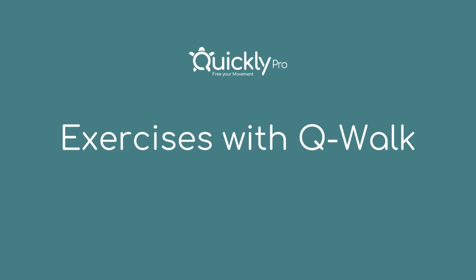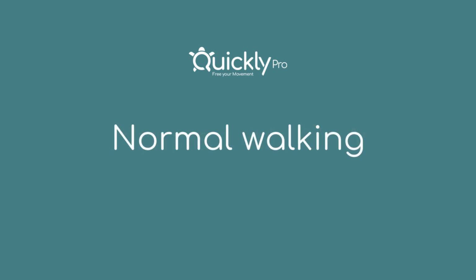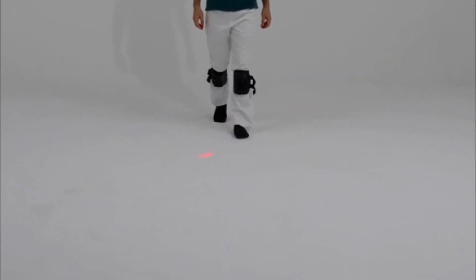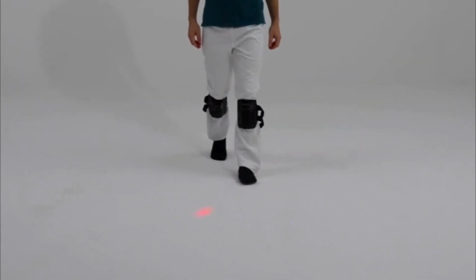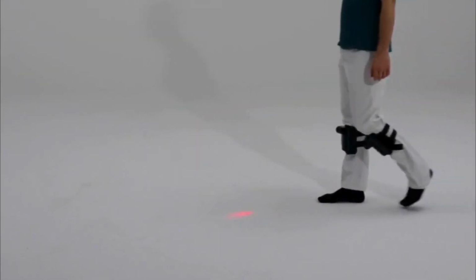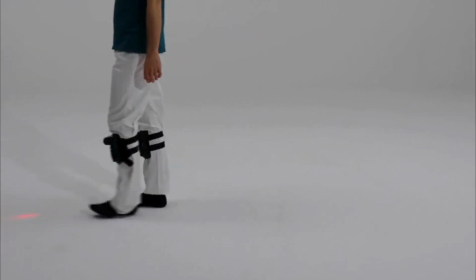Exercises with cue walk. Normal walking. Typical gait training with the use of cue walk. Visual feedback guides the foot placement as you perform your step. Stimulates gait lengthening when the projection is set farther away than the patient's standard stride.